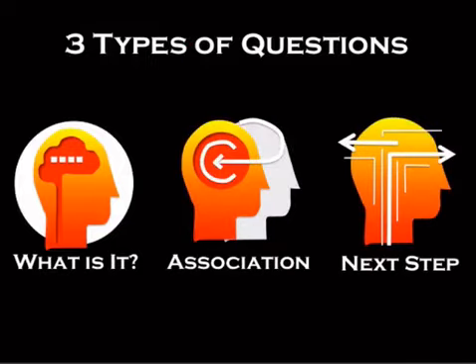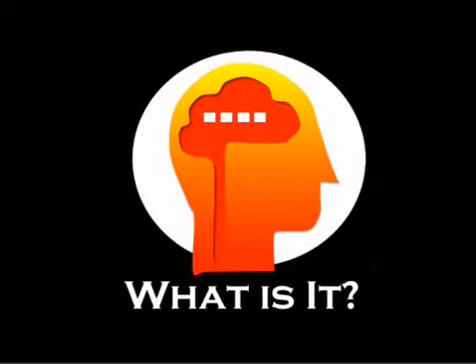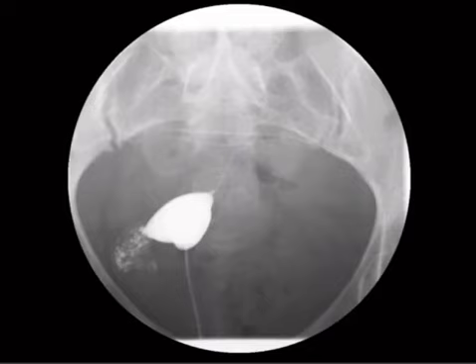Alright, 3 main types of questions, similar to the prior talk, starting out here with one of these. So, if you see an HSG, there's a couple of things you need to think about. One is going to be malformations of the uterus. I think that, if on the oral board's examination, it would have been completely fair game, and believe me, it still is fair game. Anything is fair game.